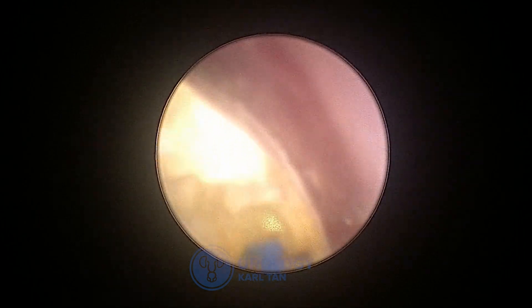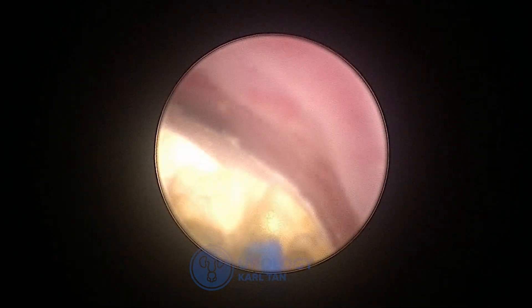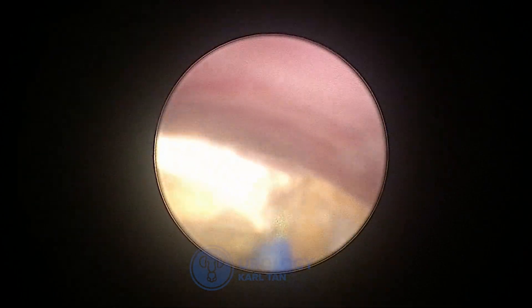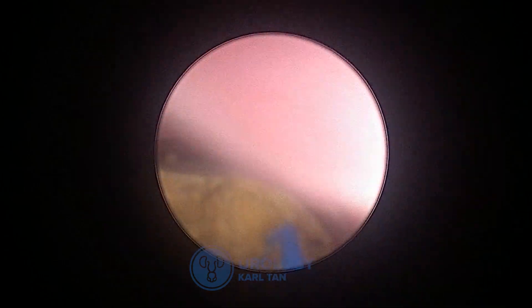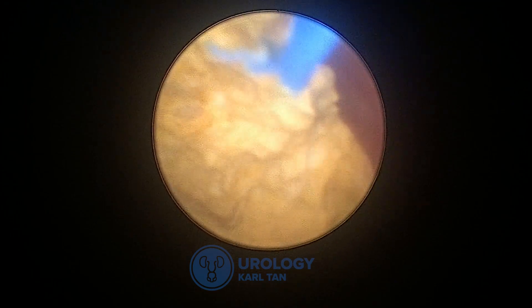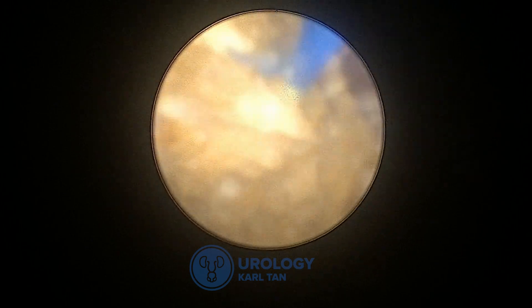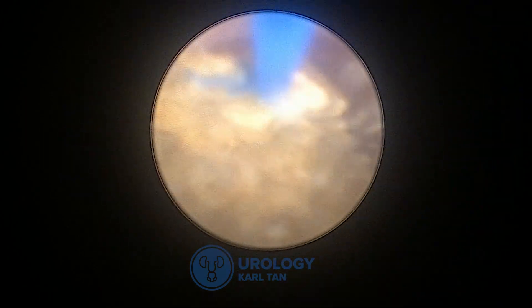You can see we don't really go back and forth removing fragments — most of them are turned into dust and easily passed downwards toward the ureteral orifice. There's no real retropulsion when using the Thulium Fiber Laser; the stone stays in place. There's not much turbulence happening inside, and you can see your progress very clearly when using a Thulium Fiber Laser for a ureteral stone. You have to make sure your laser settings are just right.